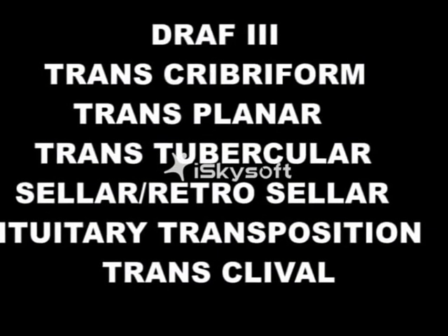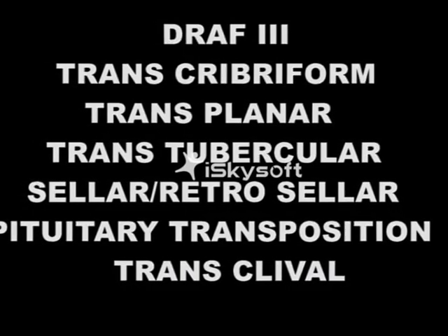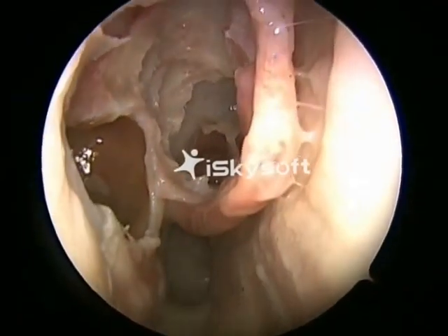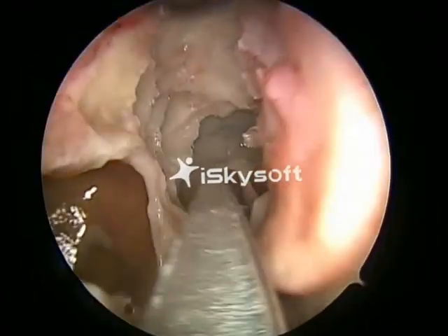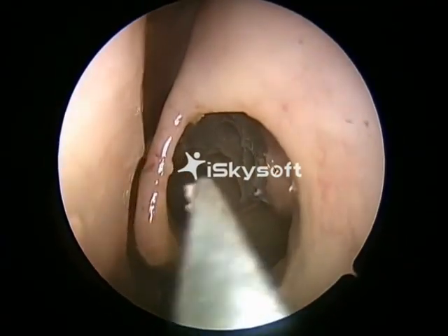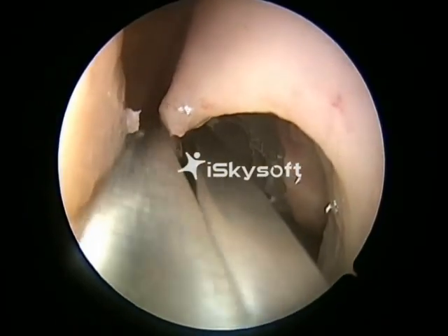Here we are going to show Draf 3, transcribriform approach, transplanar, transtubercular, sellar, retrosellar, pituitary transposition and transclival approaches. We have done a total sphenoethmoidectomy on both sides. This is another cadaver, a second cadaver. The first exercise is a Draf 3 that we are going to show. It's otherwise called MEL, Modified Endoscopic Lothrop, as a first step to transcribriform approach.